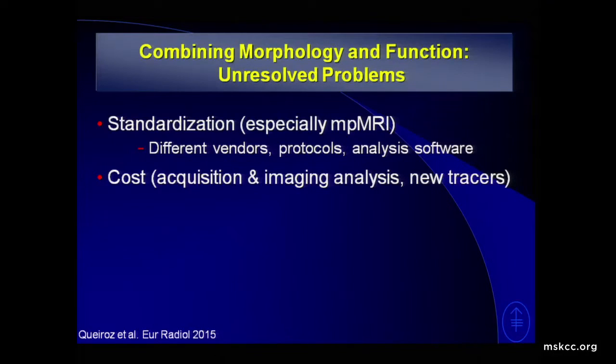And if we think of the new tracers with the advent of the MR PET, it's really exciting because with certain tracers we can interrogate hypoxia, apoptosis, and proliferation, and combine that with the wonderful and superb soft tissue resolution of the MRI. However, the new tracers come at a cost, because obviously some of them are not FDA approved. Again, the role of MR PET is to be discovered, but I think it will tremendously add to either MR or PET alone.